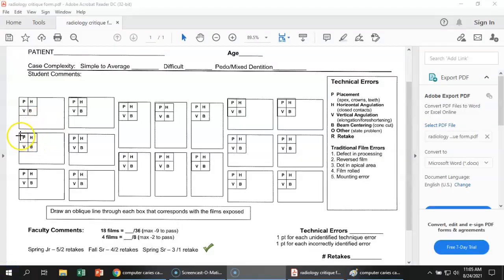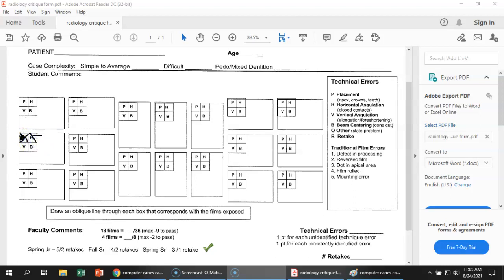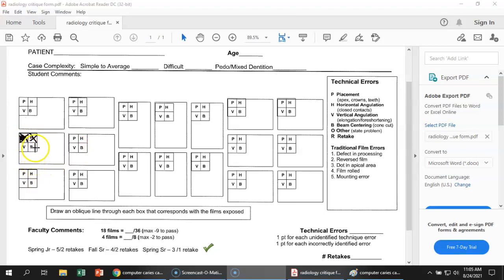So then we go back to this one. We had our X here. And we filled that in there. That was for our placement error. And then we're going to put an X in horizontal. Now you don't have to do anything else with that. You just put the X. That's just saying somewhere in my film there was horizontal angulation. And then you leave the B and the V unmarked because those were fine. So that is how you would critique that film.